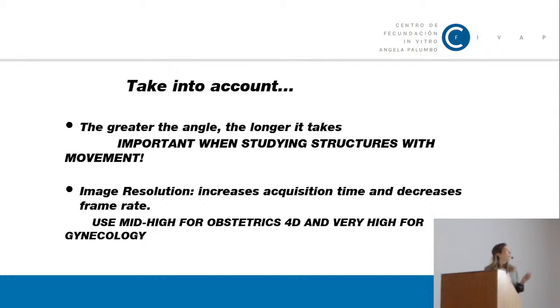And also the image resolution is going to increase the time of acquisition and to decrease the frame rate. It affects temporal resolution. So it's recommended to use mid to high resolution for obstetrics 4D and very high for gynecology.